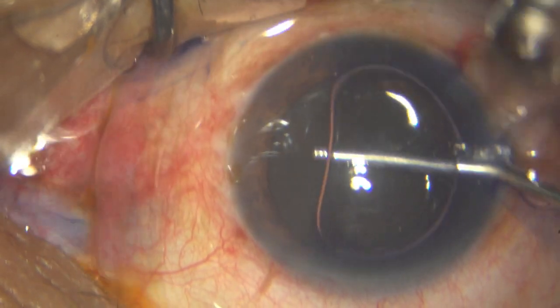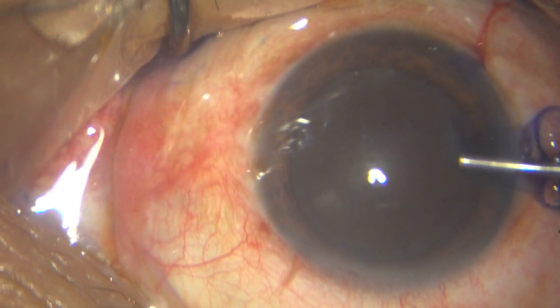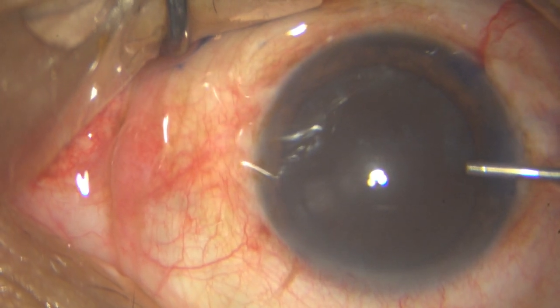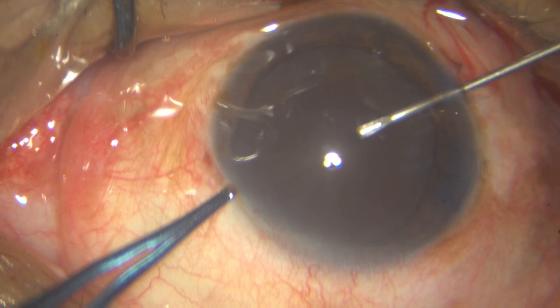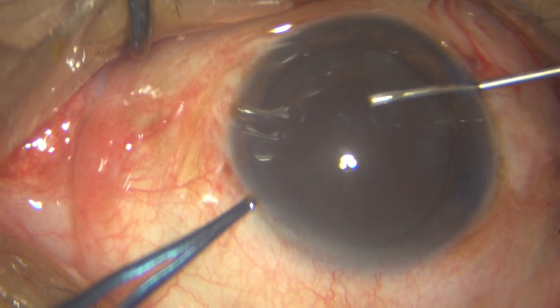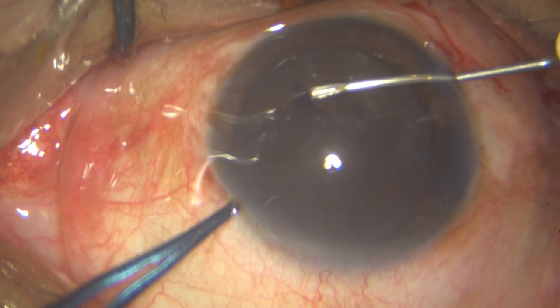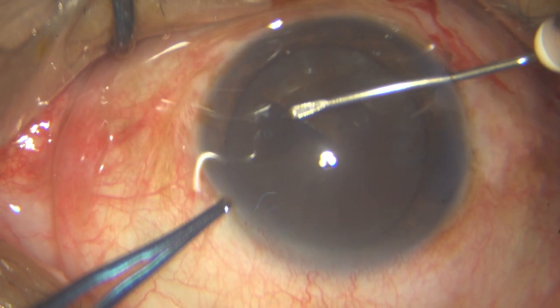So once I have stained the capsule, you can see this is an extremely hard leathery cataract in a diabetic. No red reflex whatsoever, and you need to stain the capsule. And always target a larger rhexis in these sorts of cases. Do not go for a very small rhexis. You will land up in a lot of problems.